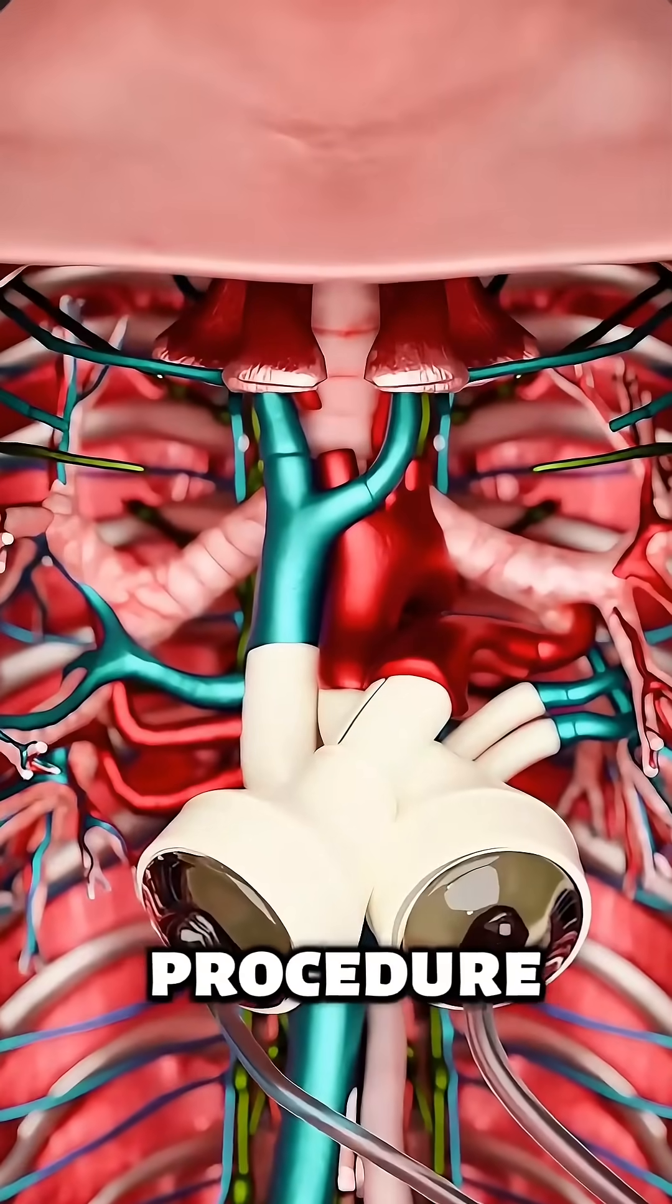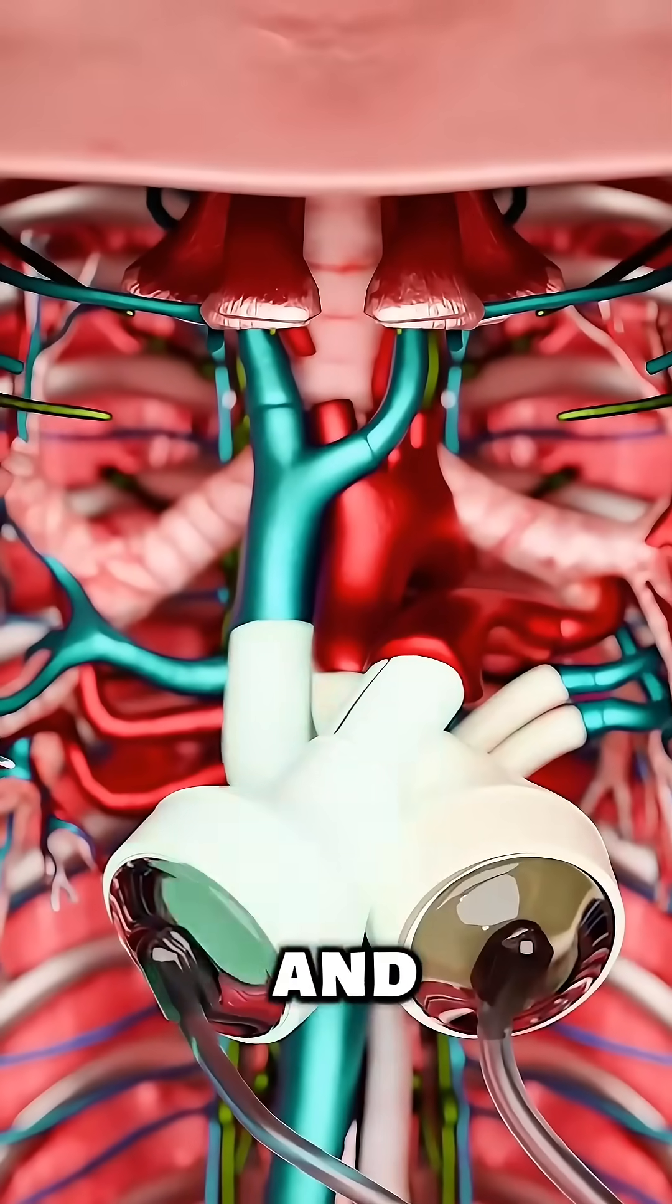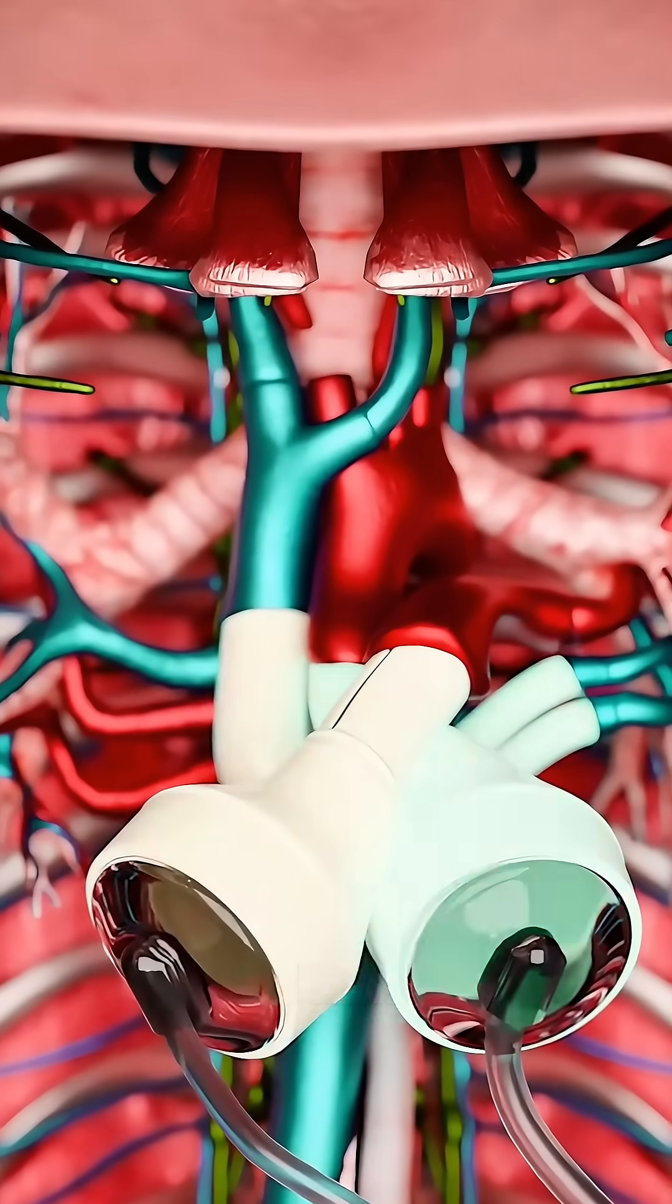During the procedure, surgeons remove the patient's damaged heart and connect a fully mechanical heart in its place.